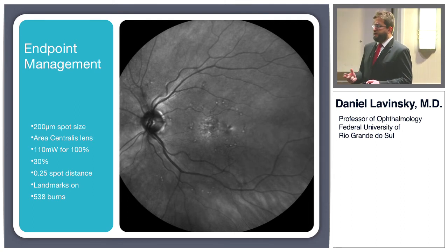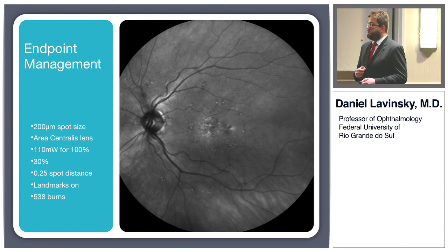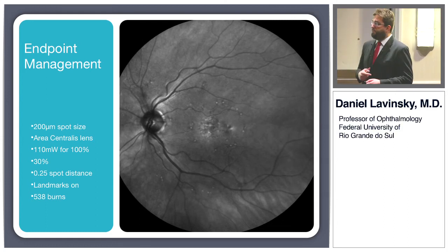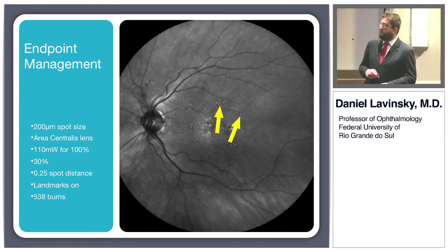For physicians, it's very hard to go beyond that, which is really one on top of each other, so 0% spacing, but I've done it and didn't see much difference in terms of scarring or anything. So we did 30%, 0.25 spacing, landmarks on, and it was 538 burns, because this was a chronic, very hard case.